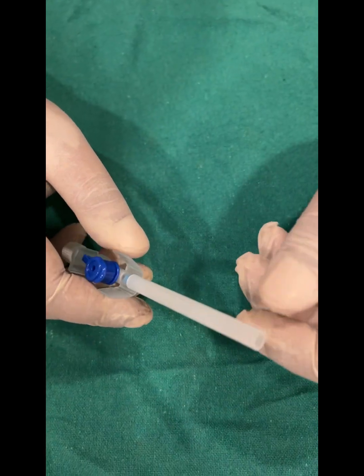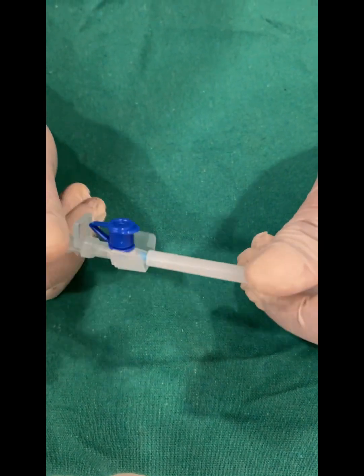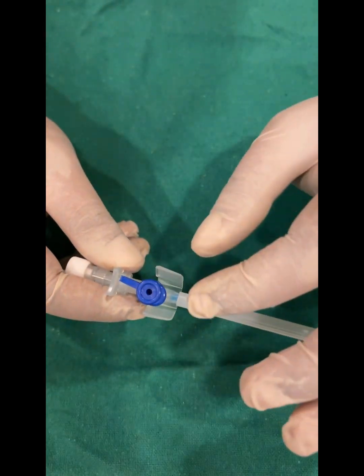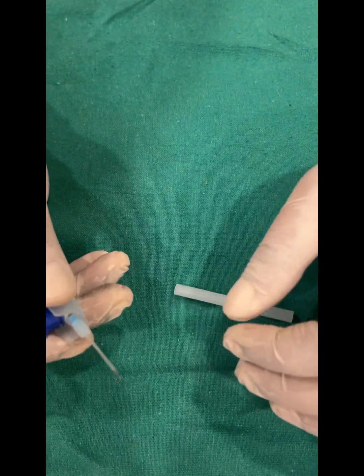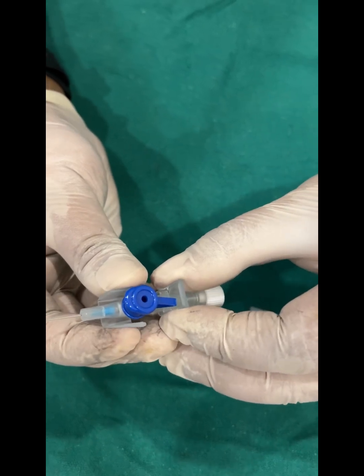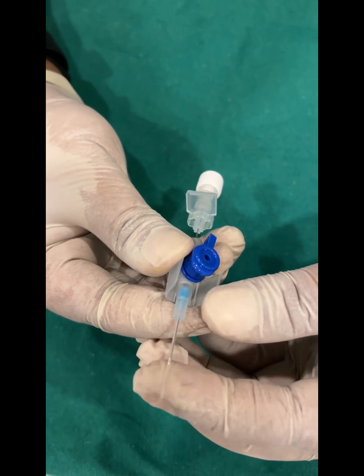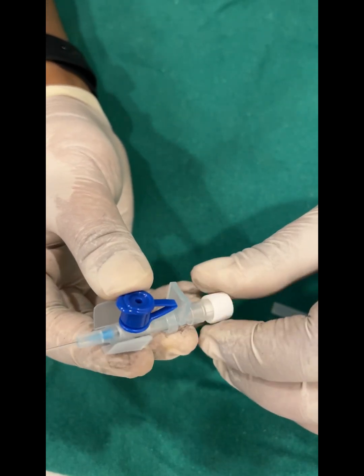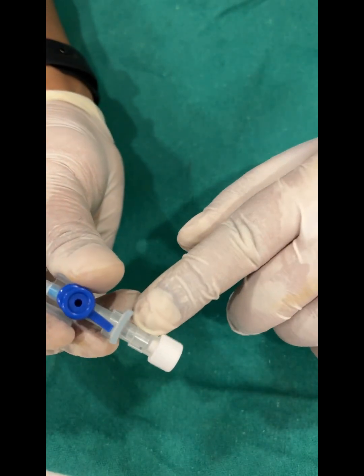Before we start, let's discuss the parts of a cannula. What we have here is a 22-gauge cannula. The color coding will tell you what gauge cannula it is — commonly we use this 22-gauge cannula. There's a cap over it; removing it reveals the needle, which is encapsulated in the catheter. Removing the needle shows the catheter itself. These are the wings, this is the cap, and this is the flashback chamber.